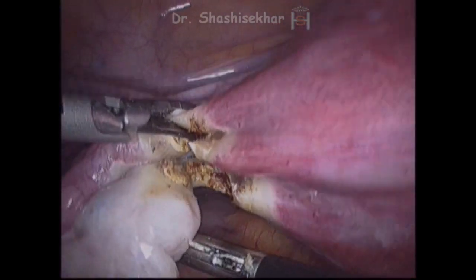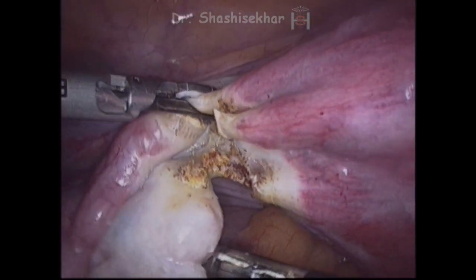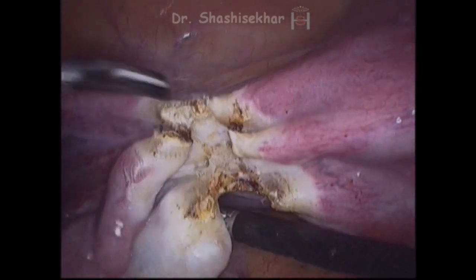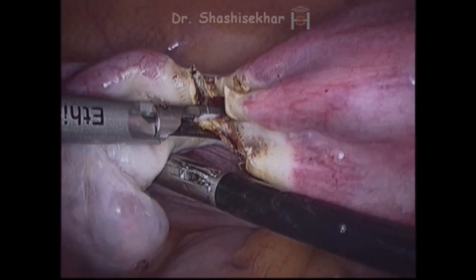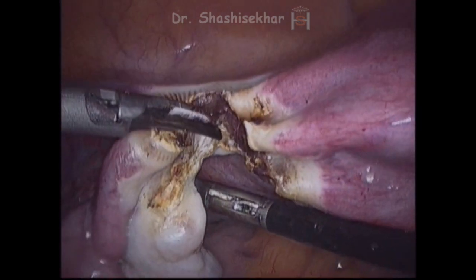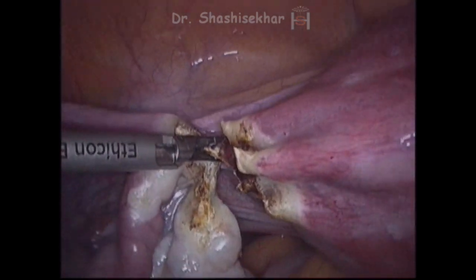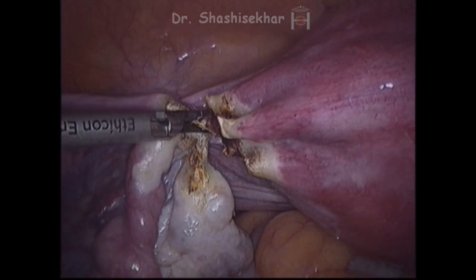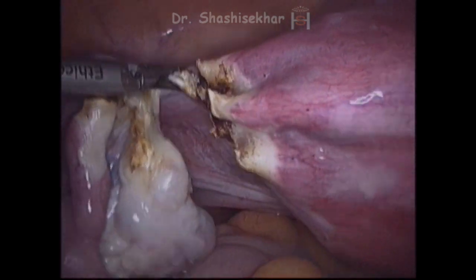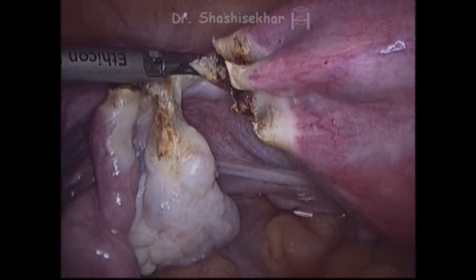Even after taking so much of care, there is every chance that there might be a tiny culprit vessel which will bleed, or there might be a back bleed from the uterine side. All you need to do is apply a little bit of pressure and some more cautery — this is not something to be afraid about. But you need to be careful that you are not injuring the sigmoid colon or the rectum, which is just beneath these structures, and you should not go far down without dissecting the layers separately.